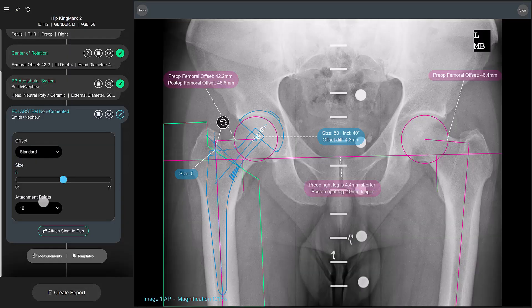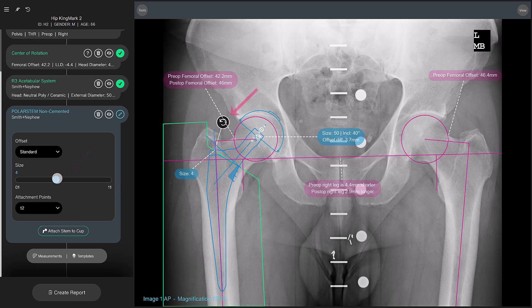What you should do first is review the size. To go one size down, drag the slider on the left to the left. You can also move and rotate the stem until the outcome is what you're looking for.